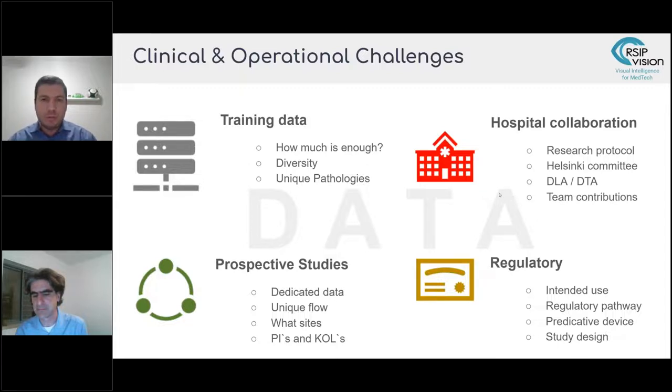And if we're talking about 2D data, like ultrasound images or X-ray maybe, then to get to a production level we'll probably need several thousands of different images. That's regarding segmentation. If we're talking about classification, once again the rule of thumb will be more or less 1,000 studies per class. So for example, if we have one class without cancer and one with a tumor, we'll need 2,000 images. And to get to a production level, we'll need probably around 10,000.